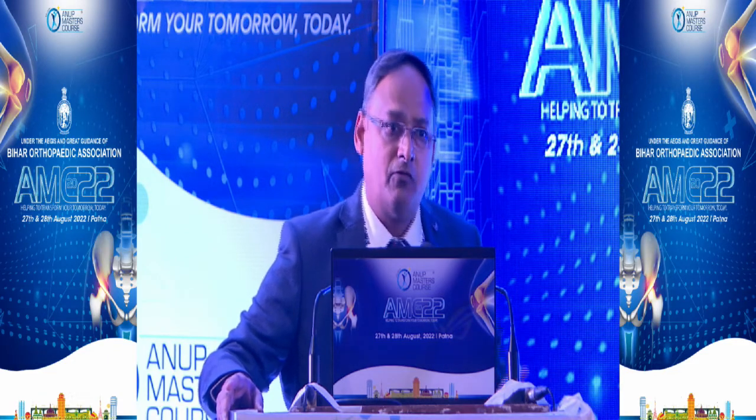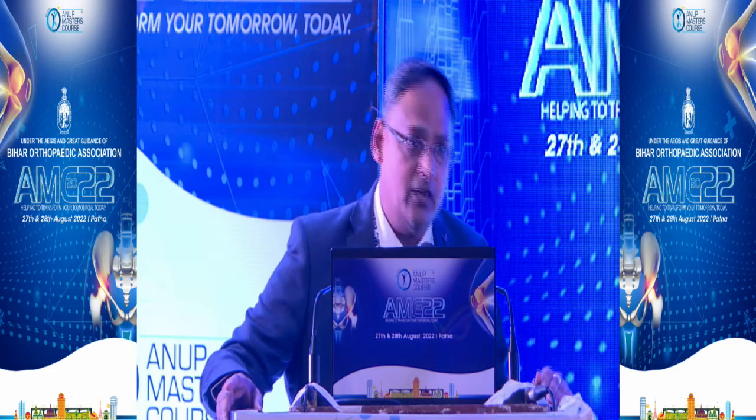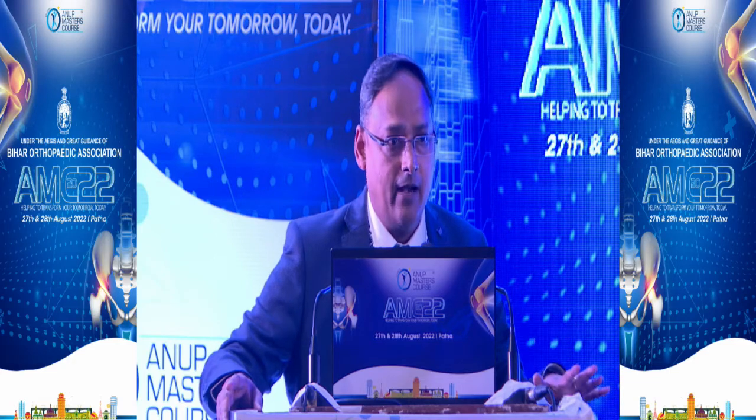We do a thorough CT scan, see the amount of bone loss, and accordingly plan what we require. We have metaphyseal sleeves, we have wedges, and we can even use corticocancellous bone graft from the iliac crest. Then accordingly we have to plan. But first priority should be given to taking care of the infection.